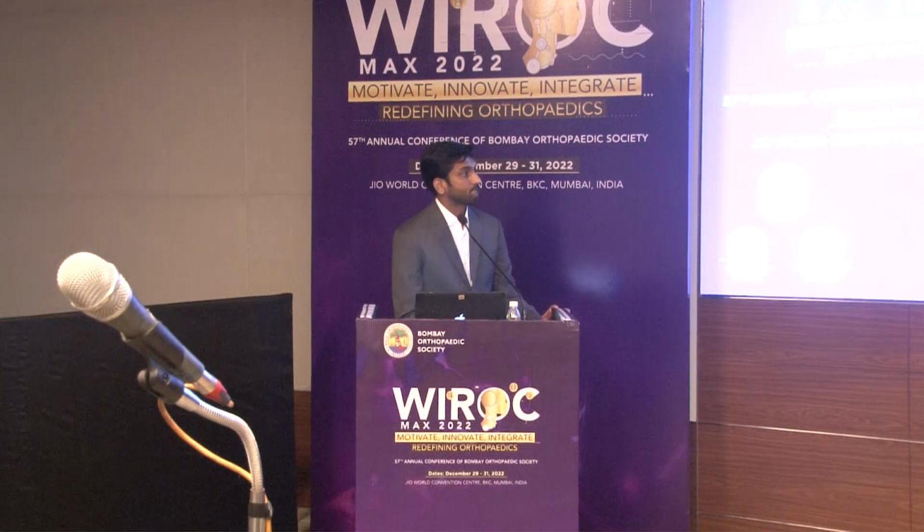For all the cases, you had deflated the tourniquet? Yes, before cementing, after cementing, before closure.